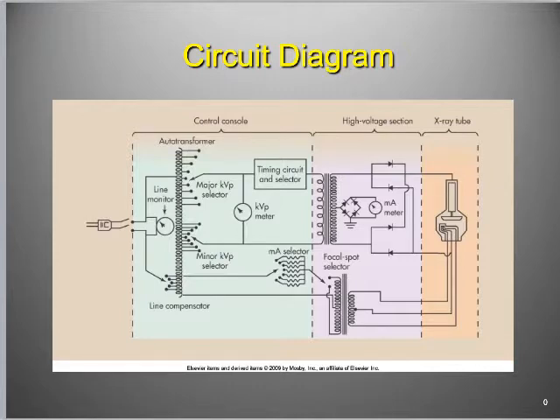So when I hit the rotor switch, right, the rotor is going to start spinning on the anode, and the filament's going to start heating up, right? And the reason it's heating up is because I've stepped up the amperage, I've stepped up the current, and I've increased the friction because the current's trying to run through this little tiny filament.